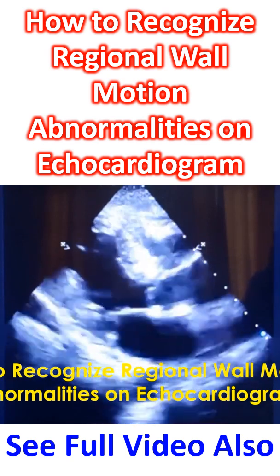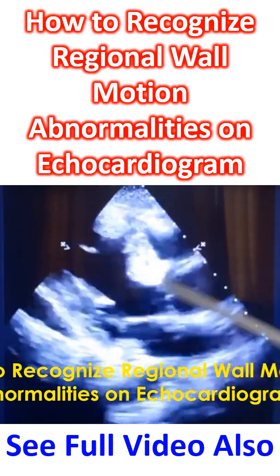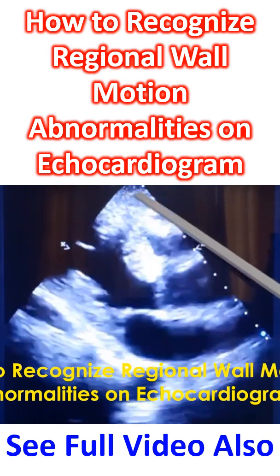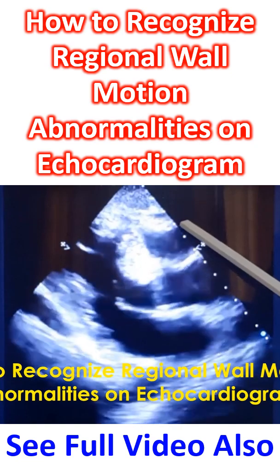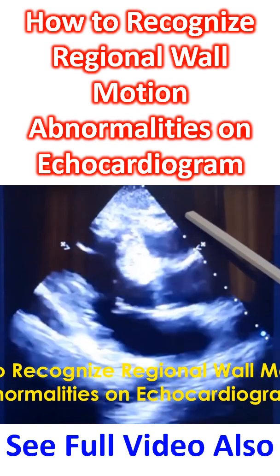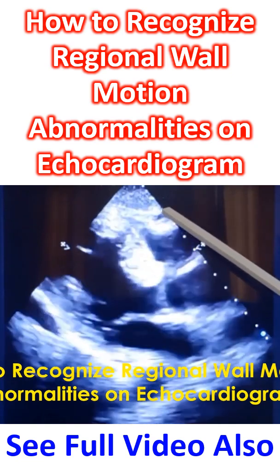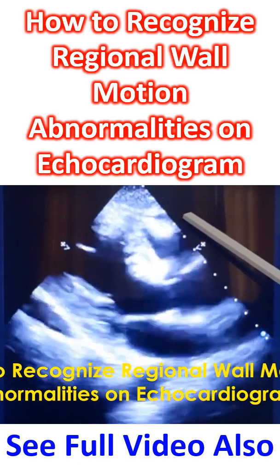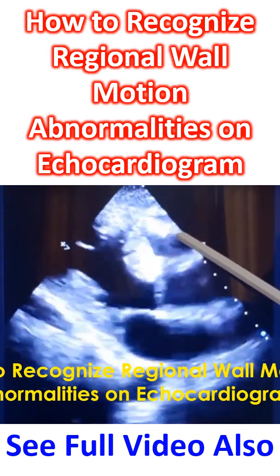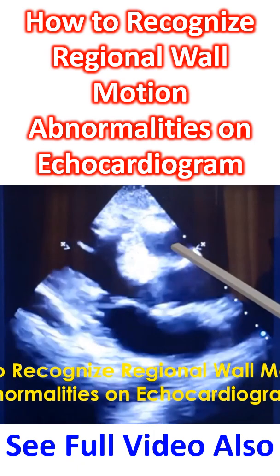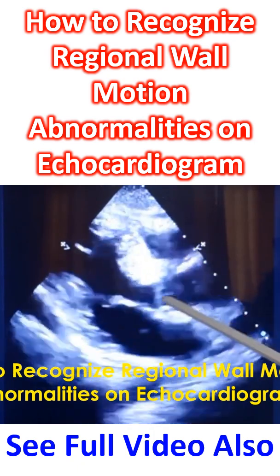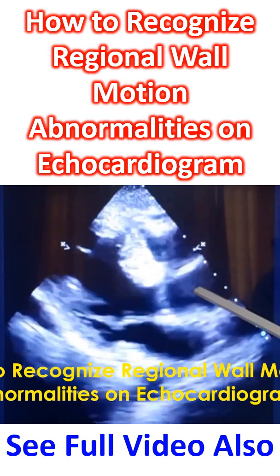This is an echocardiogram from the parasternal long axis view. In the parasternal long axis view, the transducer is placed in the left parasternal region, usually in the 4th left intercostal space close to the sternum. The transducer is rotated to obtain a good image. Long axis means from the base of the heart to the apex.